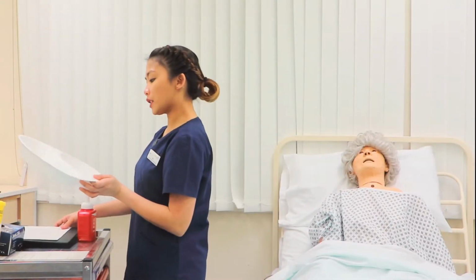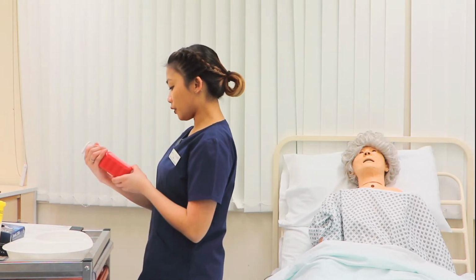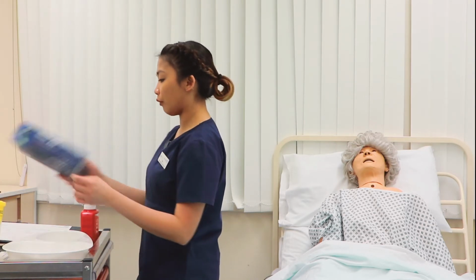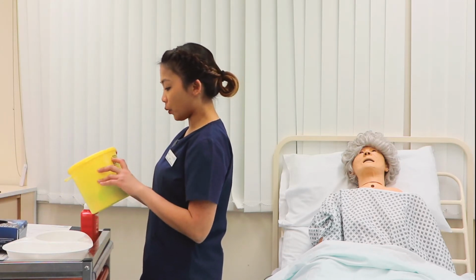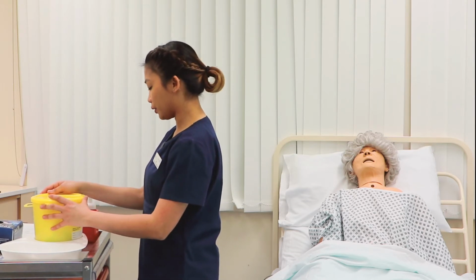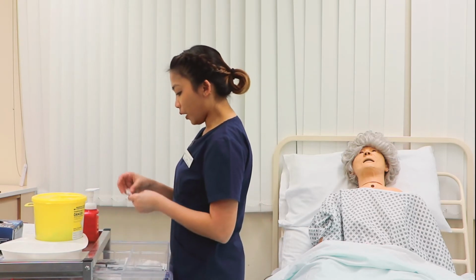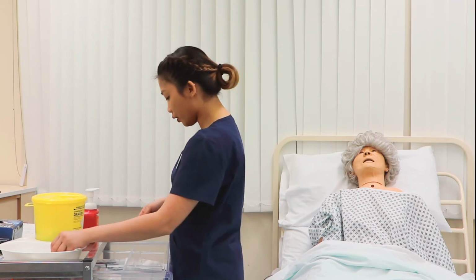I have here my tray, cleaned and disinfected within the last 24 hours, safe for me to use. Hand rub, clean, dry, and intact, expires 2024. A box of gloves, clean, dry, and intact, expires 2025. Sharps bin, dry and intact, it's not past the warning line, and I can open it 3/4 and close it 3/4 after use. Two alcohol swabs, clean, dry, and intact, and expires 2024.